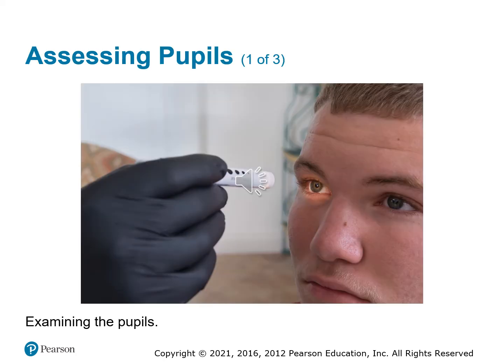And this is just a quick visual here to show you kind of what we talked about there. So he's running that light source over the eye and then back off. If you look close, you can see those dots on that little pen light. Those are going to indicate what size it is. So you can compare what you see in the eye to that size on that little pen light, and it'll give you a measurement that you can utilize and mark down as your baseline.